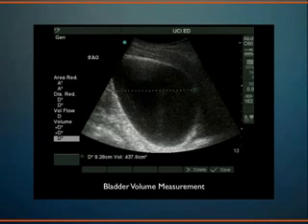So measuring the prostate and having that post-void residual is good information in many different locations, whether you're in the outpatient clinic, the ER, or the ICU. Those are all good information to have about your patient. Does that answer your question?